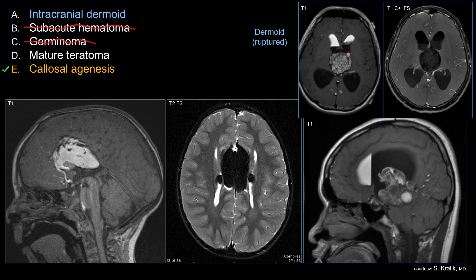For intracranial dermoid, you can see a fatty lesion with T1 shortening — bright T1 signal — with subsequent signal drop after fat saturation. Compared to the relatively homogeneous signal of a lipoma, dermoids tend to be much more heterogeneous in signal intensity. In this case, you can also see a non-dependent layer of the fat element — fat floating to the top — indicating a ruptured dermoid. Dermoids tend to be much more heterogeneous and typically do not contain as much fat tissue as a lipoma.